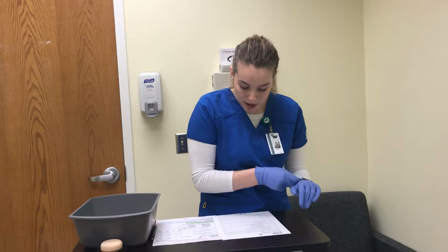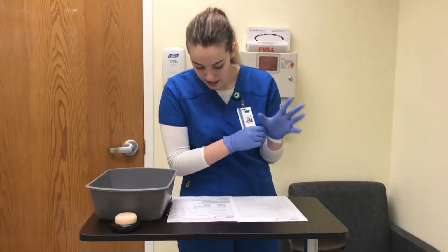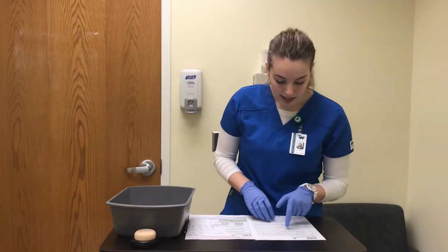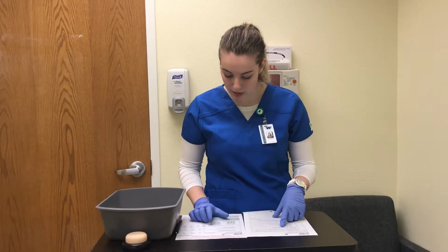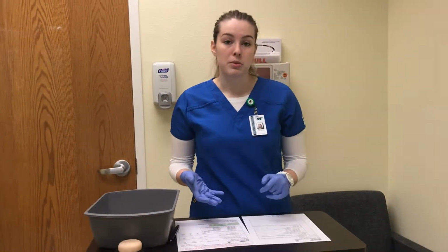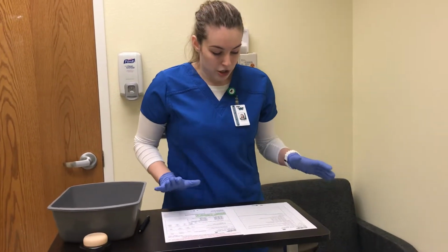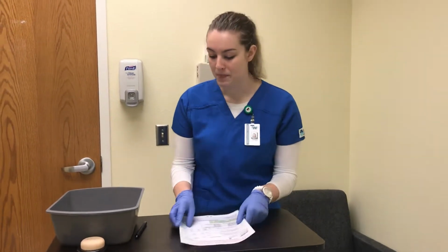And then I have my Practi Insulin Lispro U100 insulin pen, and that is a mild sliding scale sub-Q TID with meals. So with my sliding scale, I know that I have to know the blood glucose before administering the insulin, so I know how many units to give. So now that I know that all that matches up, I can go on to my medication checks.